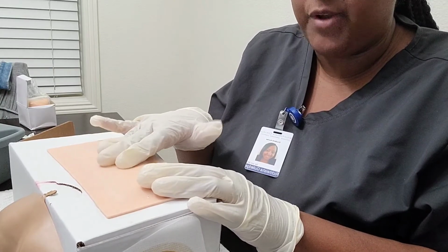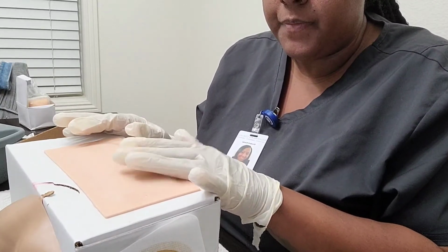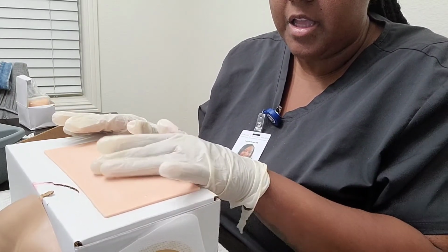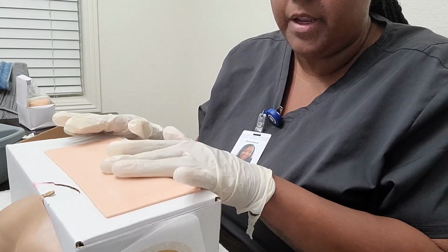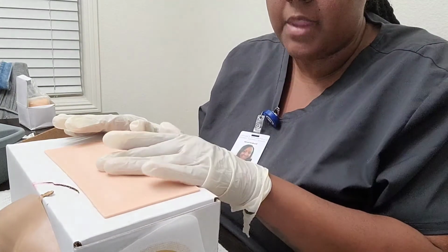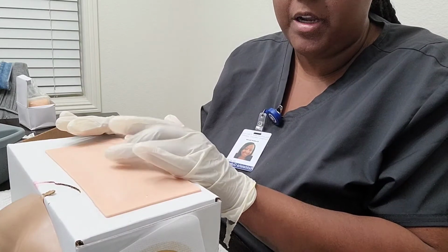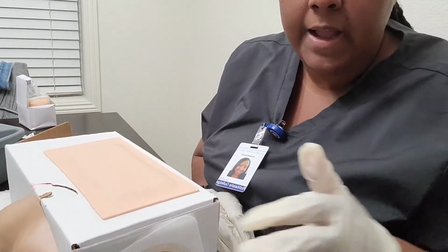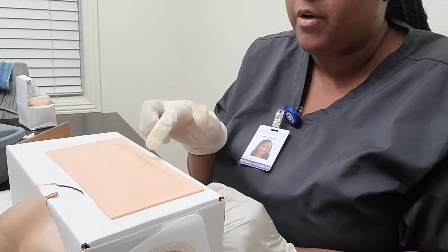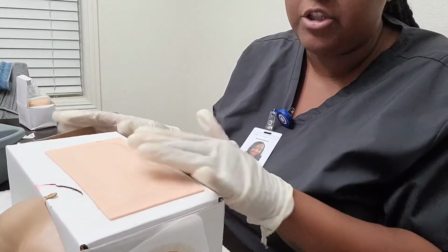And for frequent injections, rotate the site. I will rotate, choose another site. So I will then go ahead and relocate the site using anatomical landmarks. For the landmarks, for example, if there was a stretch mark here and then a stretch mark here, then I will go ahead and have my site in the middle. So that's how I will pick the location of my site.